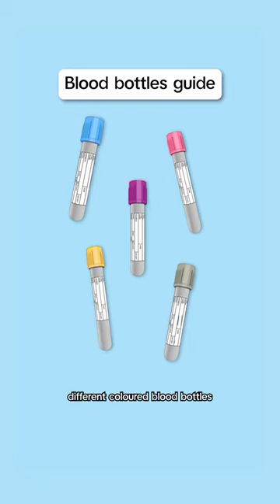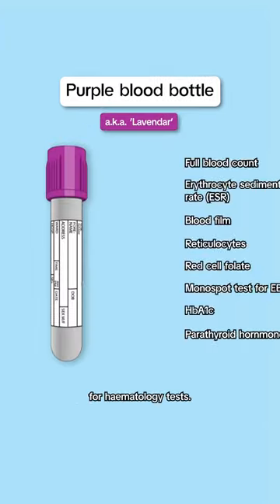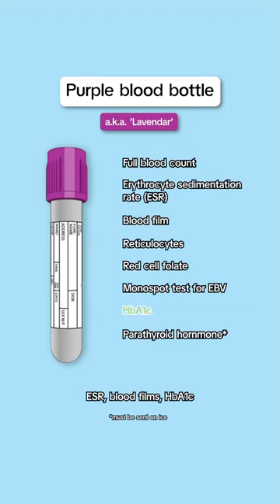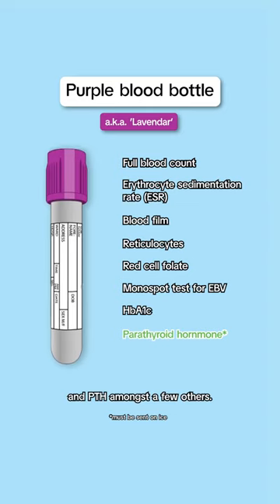Here's a quick guide on the different coloured blood bottles and what they're all used for. The purple or lavender bottle is used for hematology tests, things like full blood count, ESR, blood films, HbA1c and PTH, amongst a few others.